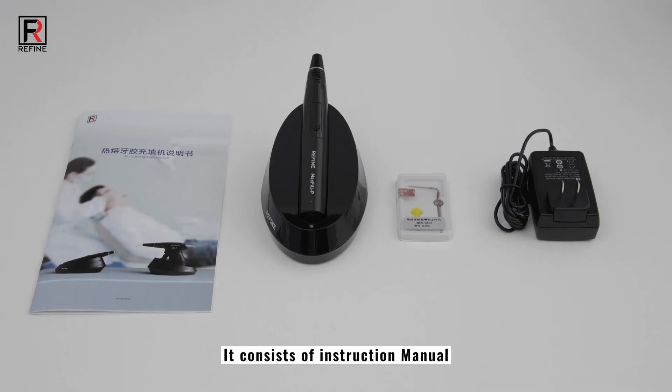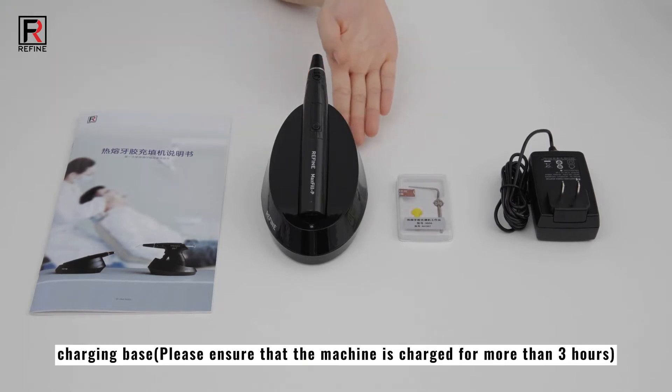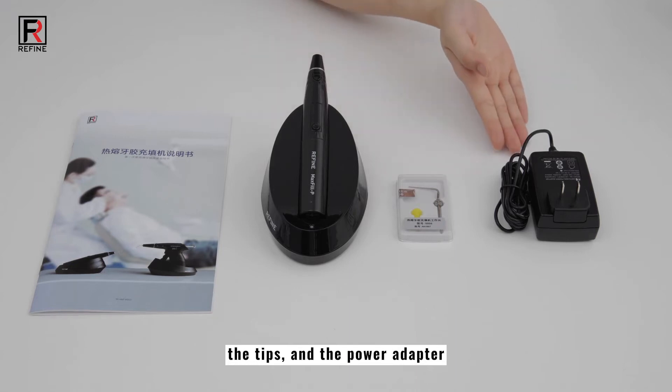It consists of an instruction manual, main unit, charging base, the tips, and the power adapter.